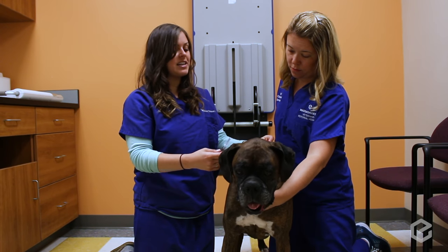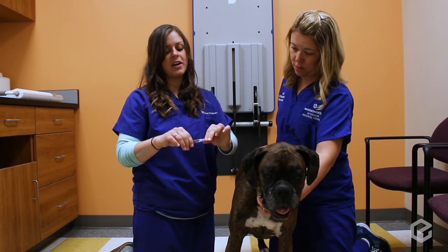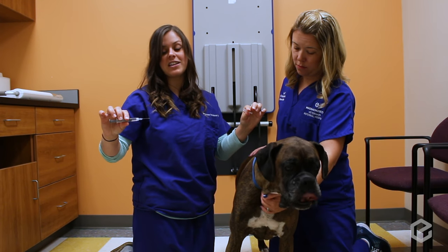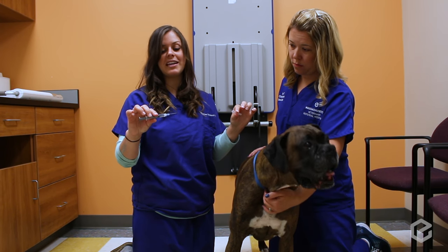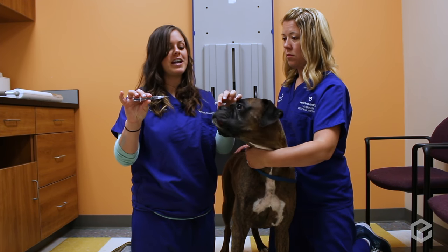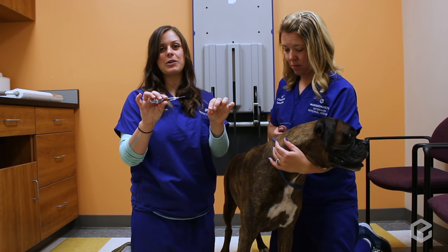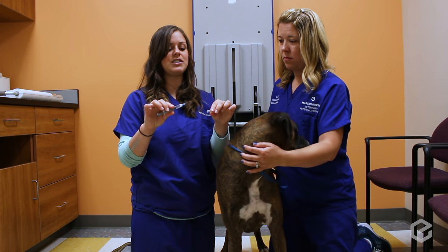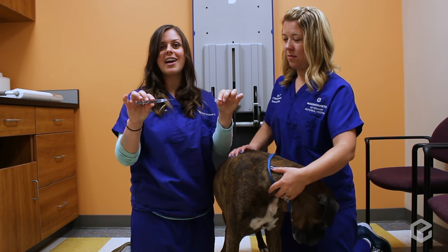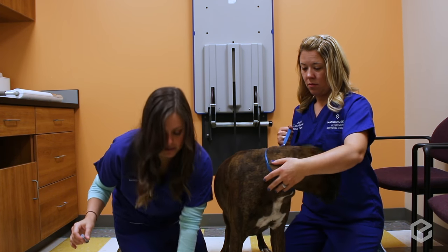When you're ready, take the cap off. Pull your hands right apart — it should come off very easily. I suggest pulling your hands straight apart instead of trying to stop the motion, because your hands have a tendency to want to stop the jerk, and that's how people get poked. Once the cap is off, you're all set.